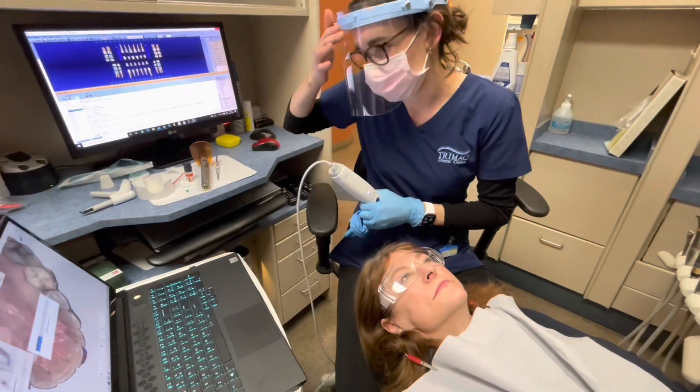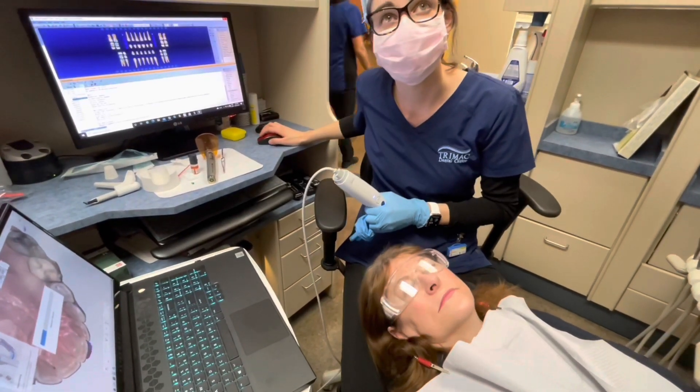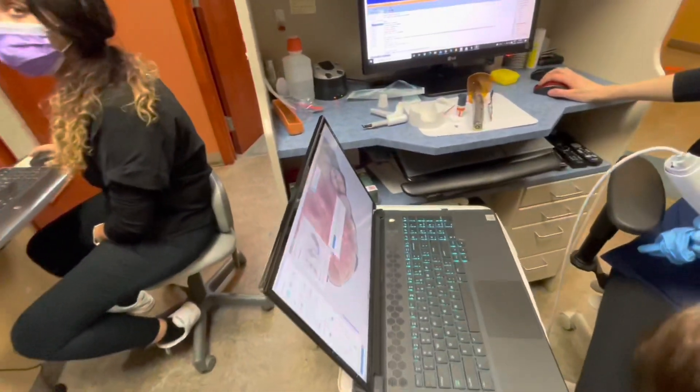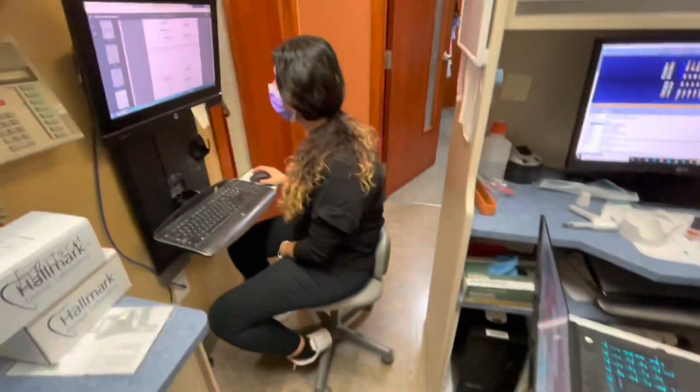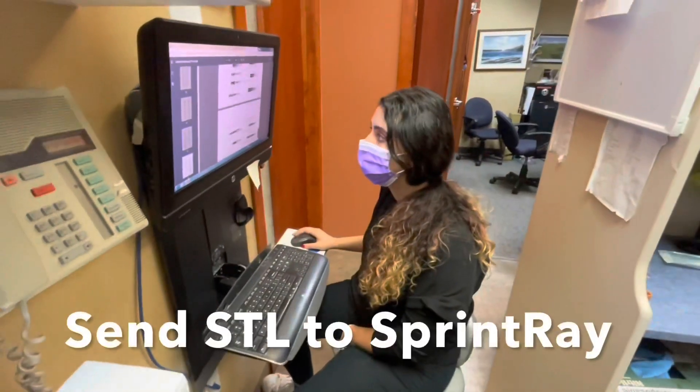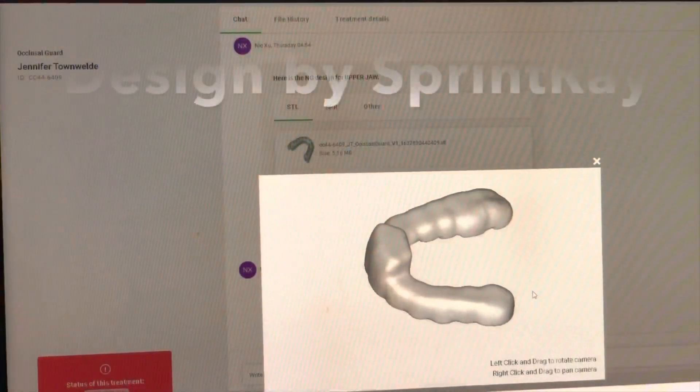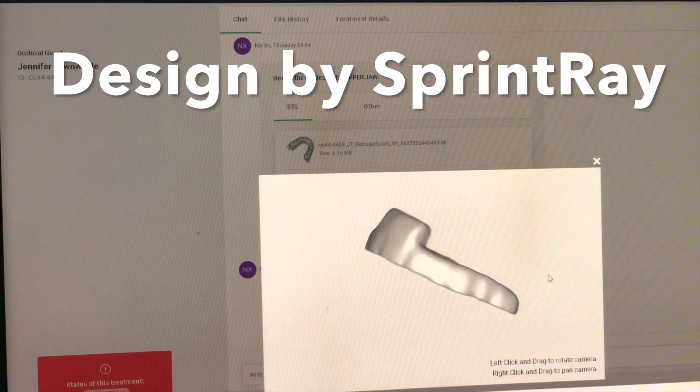We're going to take that file and use it to make a Sprint Ray biplane. My other dental assistant is going to take the file and send it off to Sprint Ray, and then they'll send back a design that we're going to take and put into the printer.